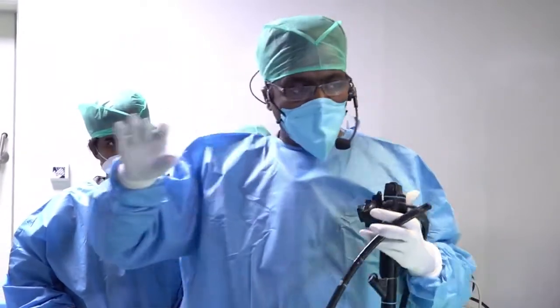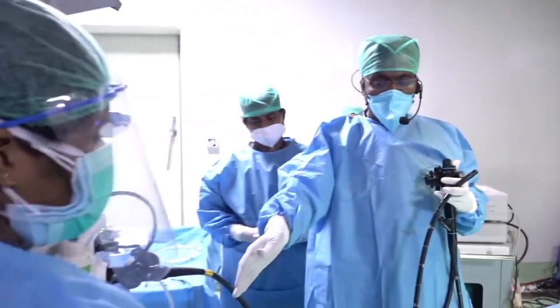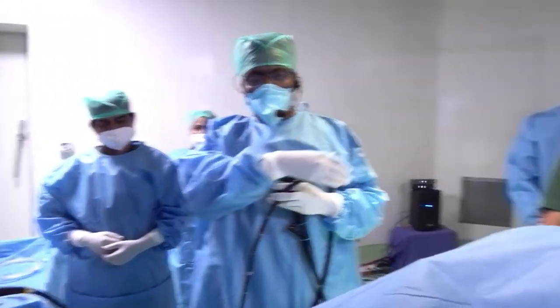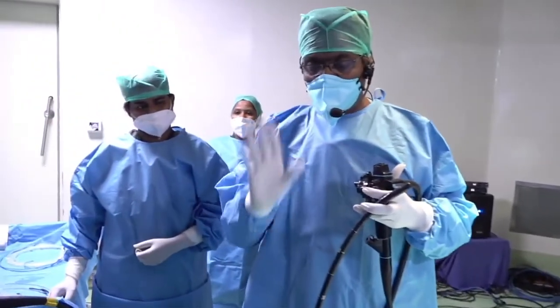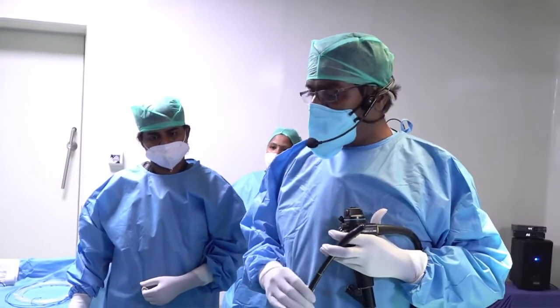as you can see, a panoramic view of my theater: the patient, my staff at the head end, and another staff member helping me with accessories. The anesthetist has intubated the patient, because I find lately that intubating the patient keeps me also peaceful, the patient is comfortable, and the cannulation rate is better. So that's my take home message for all.